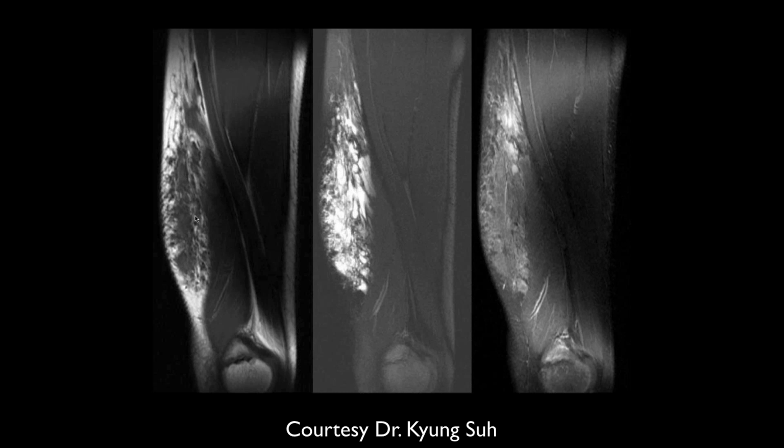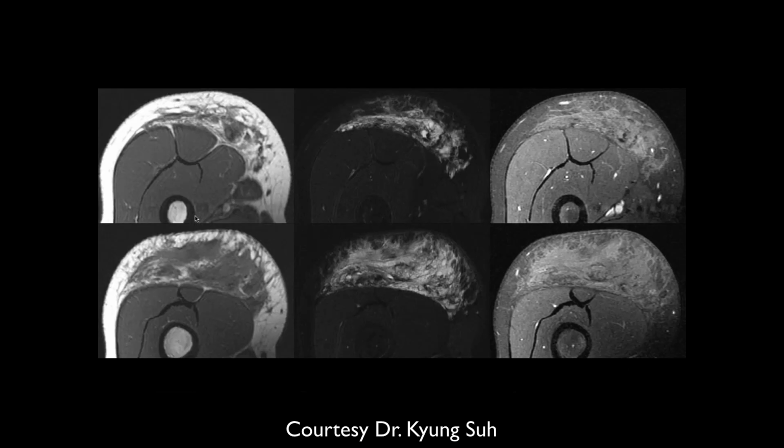But there is another lesion that could look just like this. This could be some kind of lymphatic malformation as well. Malformations.